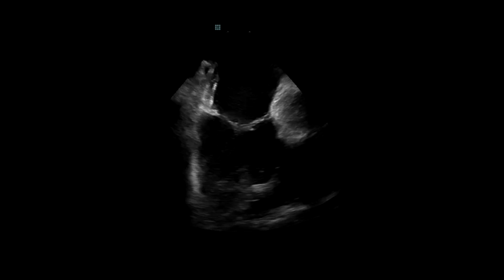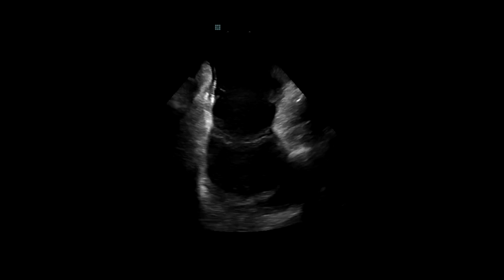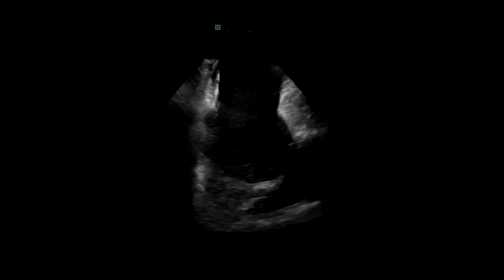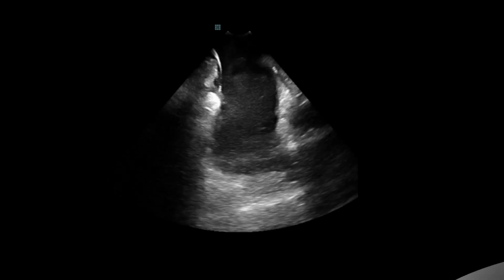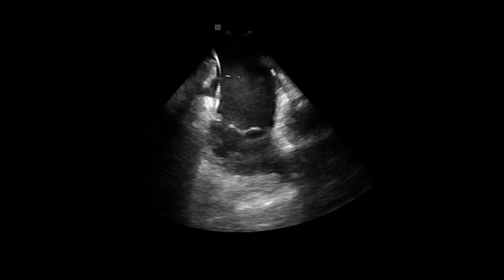This is a patient with atrial flutter. You can appreciate the ablation catheter starting from the CTI and TV junction. We slowly pull back the catheter towards the IVC, and we can see that it's contacting the tissue very well, but sometimes it is not as easy.